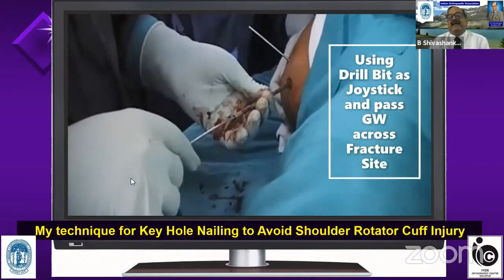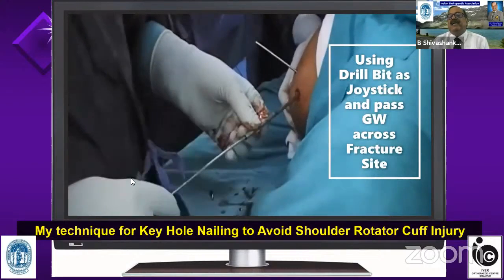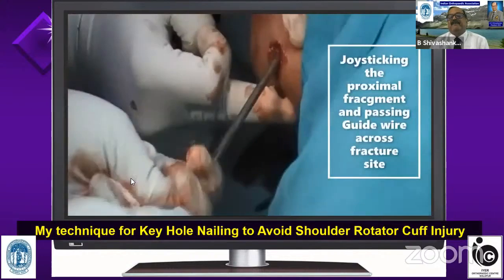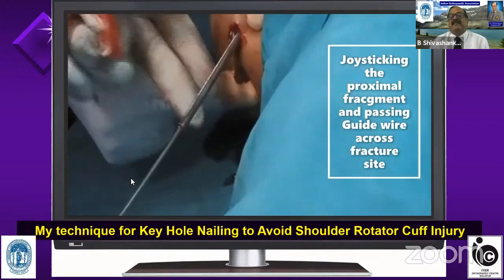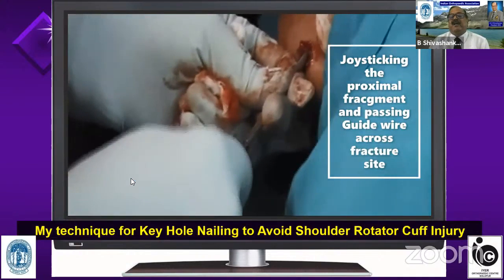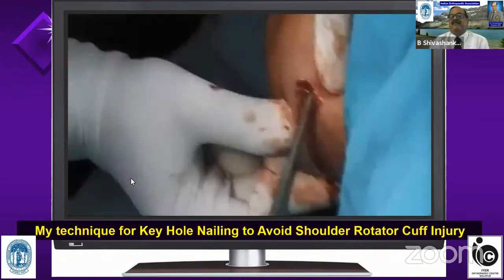I will use the drill bit as a joystick to manipulate the proximal fragment. The assistant only gives traction. The assistant will not help in the reduction of the fracture. I have the control over the proximal fragment. I manipulate the joystick of the drill bit. Then I will pass the guide wire across into the distal fragment, which I can feel and also confirm under C-arm. Now the guide wire has gone across to the distal fragment.